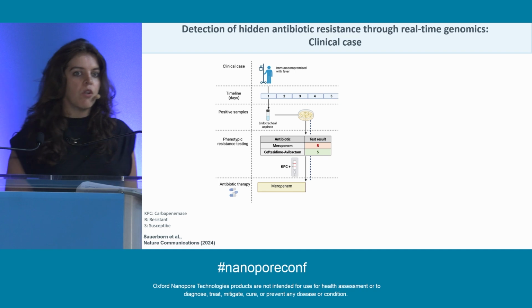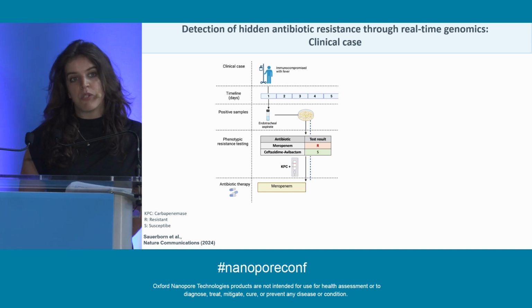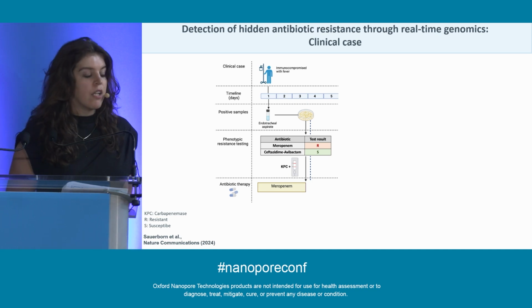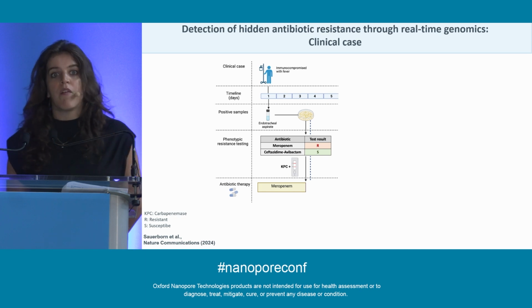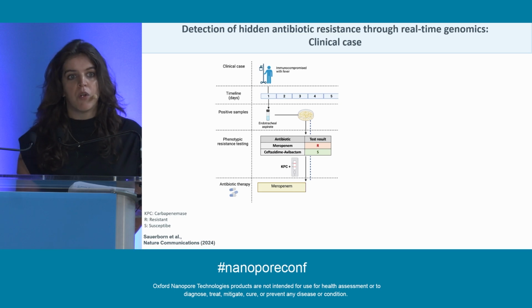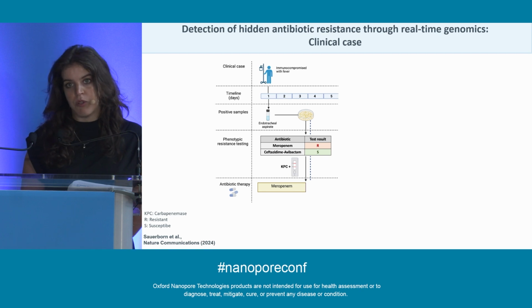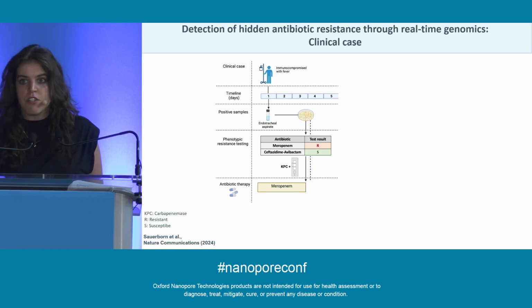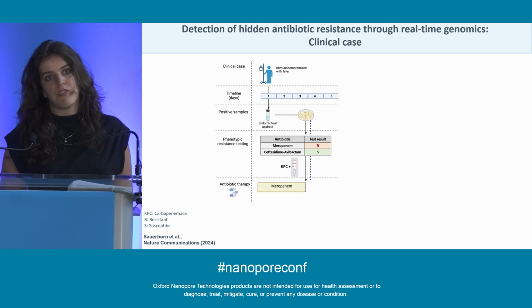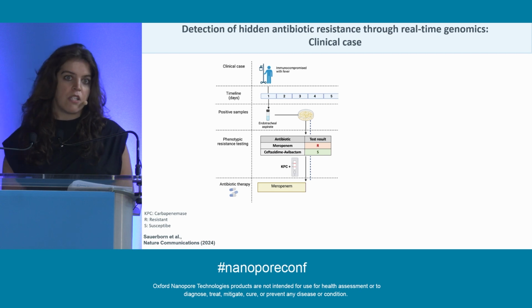In this case, an immunocompromised patient presented with a fever in a clinic and was initially treated with the last resort antibiotic meropenem, which is part of the carbapenem subclass. The first sample of this patient grew a carbapenem-resistant Klebsiella pneumoniae, with KPC, or Klebsiella pneumoniae carbapenemase, being identified as the resistance-conferring mechanism by means of lateral flow tests. With this new information, the treatment was changed from meropenem to the even more last resort antibiotic ceftazidime-avibactam, which was deemed to be susceptible in additional testing.